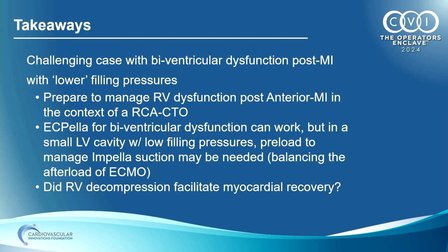And did RV decompression here help facilitate myocardial recovery in this situation is always a question. So again, very challenging case dealing with filling pressures that are low, biventricular dysfunction, and multiple different mechanisms of trying to figure out which mechanical support devices will help in these situations with regards to ECMO, ECPella versus bipella device, when medical therapy is clearly failing. So with that, I'll conclude and open up for discussion or questions for this case.